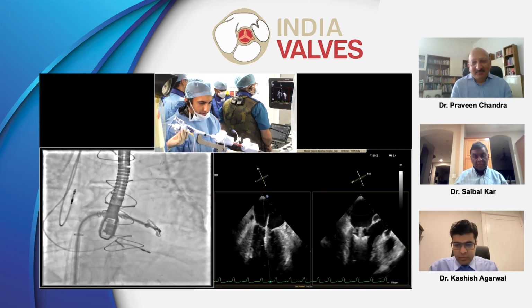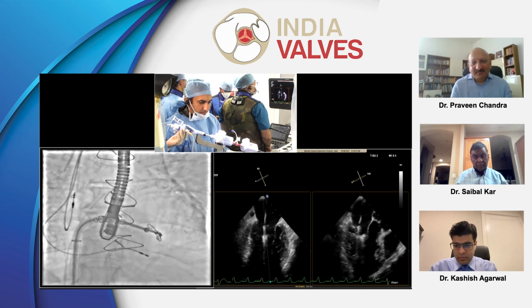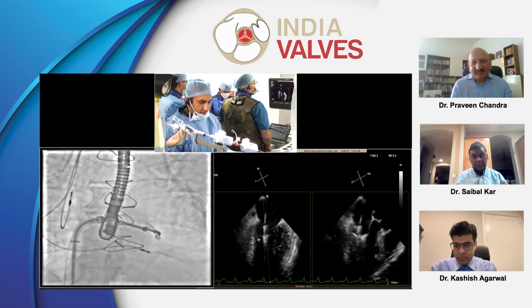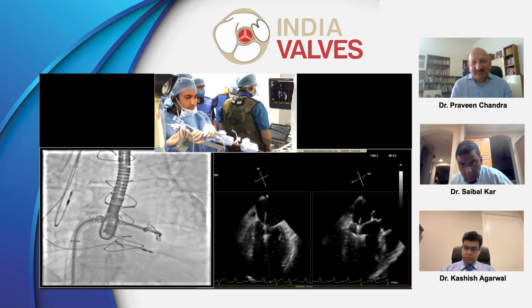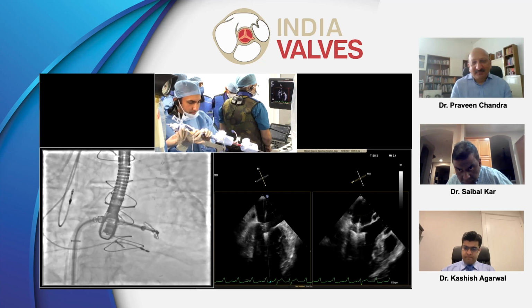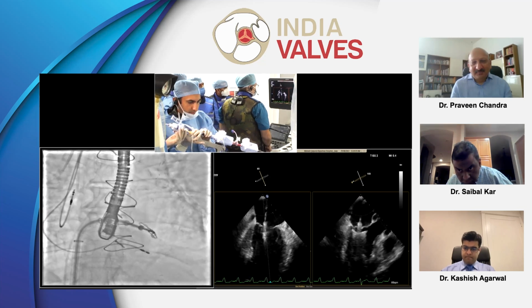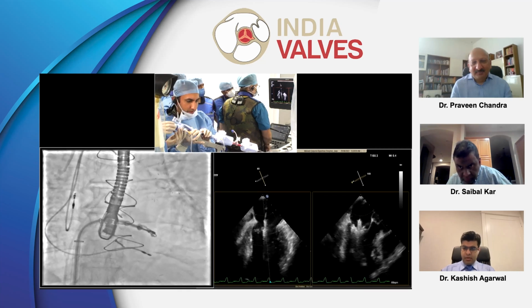Okay, let's see. Okay. I'll do it. So I'm going to pull back now. Yeah. Very nice. Drop the grippers, please. Okay, close the clip. There, you can see the grippers bouncing.